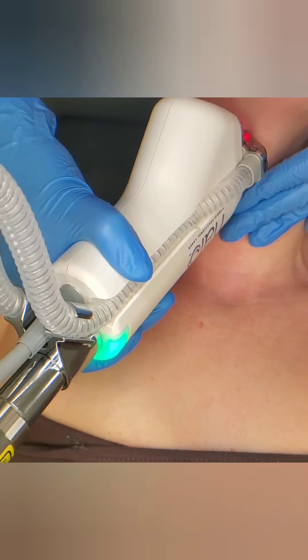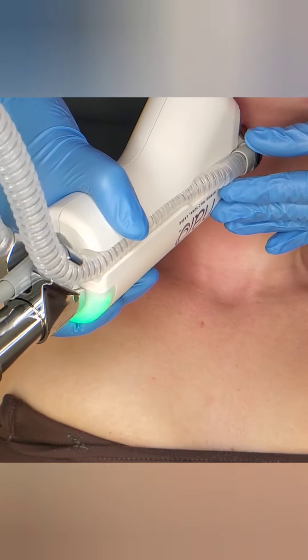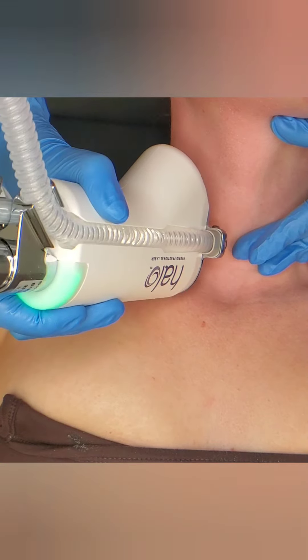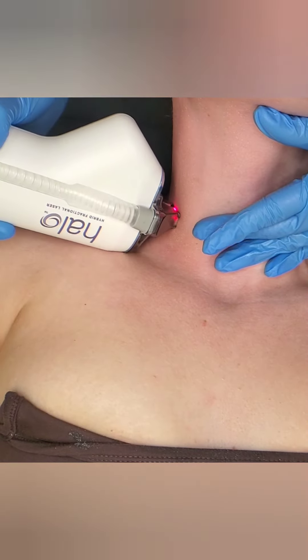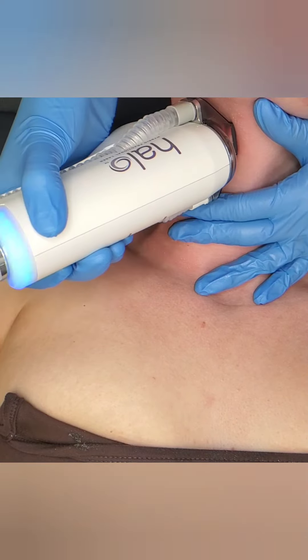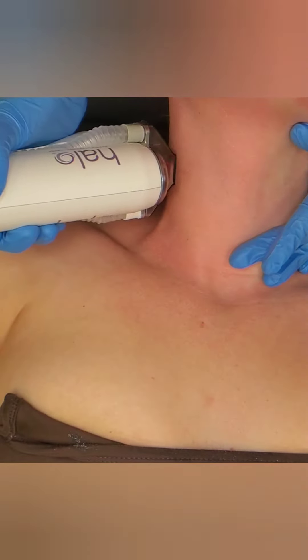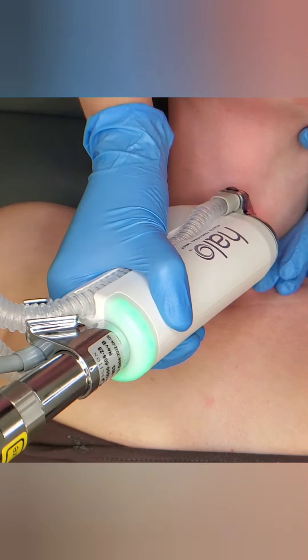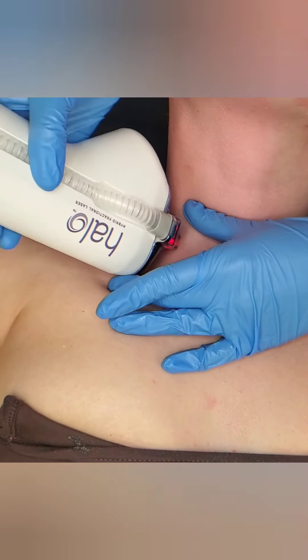I also want to mention this can treat melasma — you will have to lower your density and it's going to require more treatments, because you just cannot put too much heat into the skin when treating melasma. Likewise, lower your density when treating someone who has skin of color. One thing that attracted me to the Halo was the fact that it can treat all Fitzpatrick skin types — even African skin. I absolutely hate having to tell patients I can't treat them because their skin is very dark. Now I don't have to do that, which has made me so happy to be more inclusive.